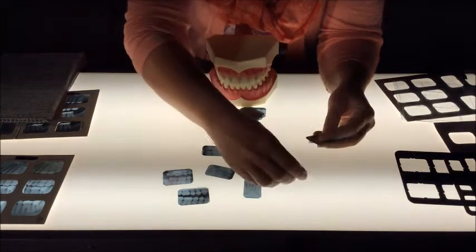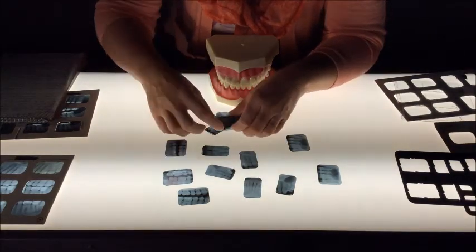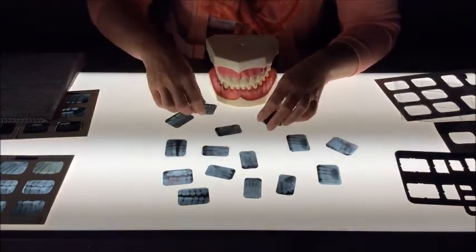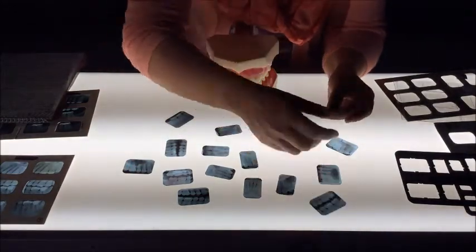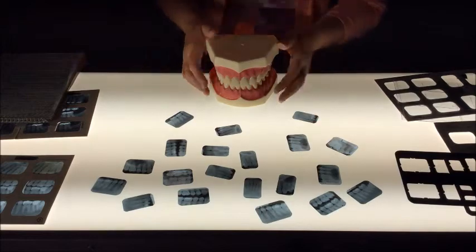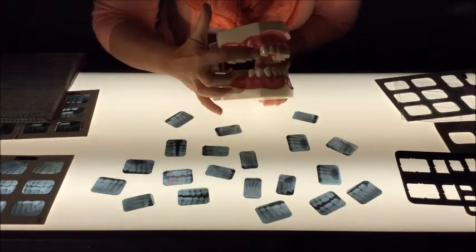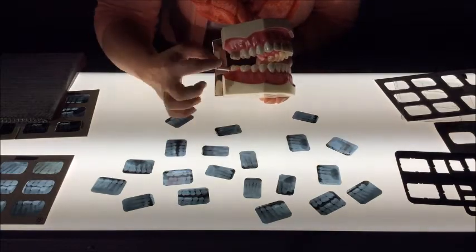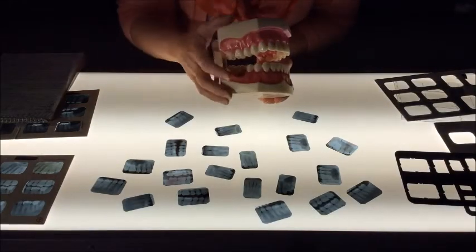The next part that we would do with our film is we would find where those bite wing or interproximal radiographs are. Remember I said to you, you want to look at the patient's anatomy. The patient's anatomy will help you to find the bite wing radiographs. Bite wings will show both the upper and lower crowns in the jaw in one view. Generally, bite wings can come in 4 to 6 or 7 types of bite wings. Generally, they take a picture of what we know as the premolars, and then they'll take a picture of what's known as the molars. The molars are wider.